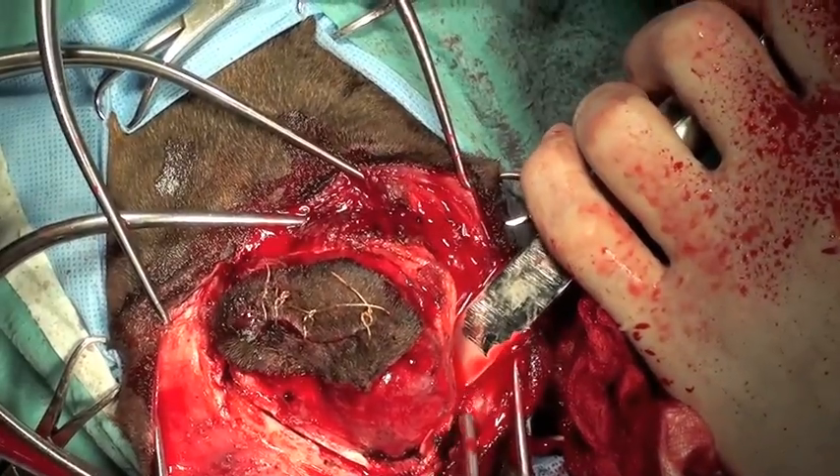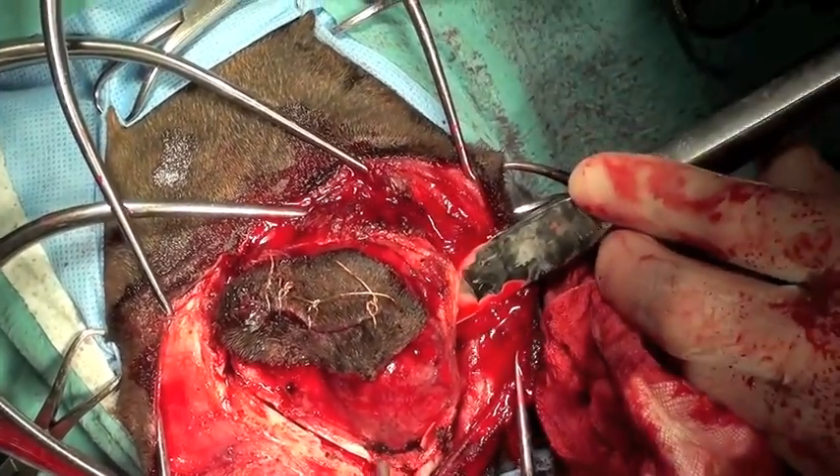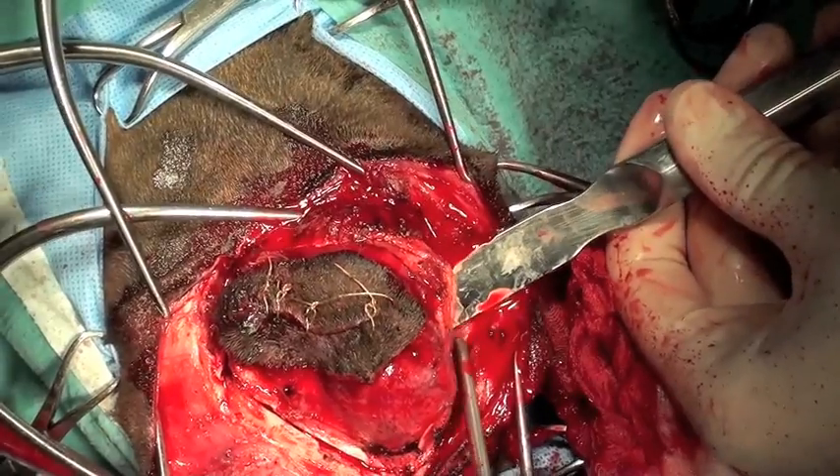The osteotome is used to complete the osteotomy and pry the tumour bone free from the skull.